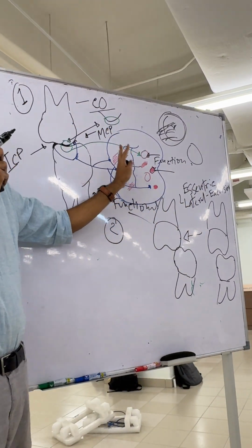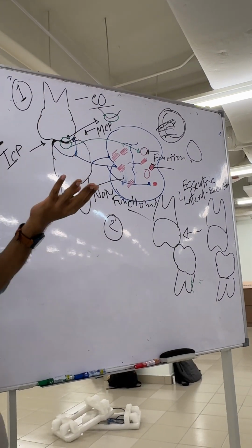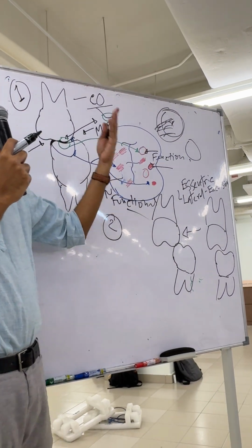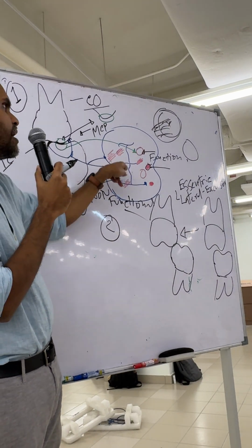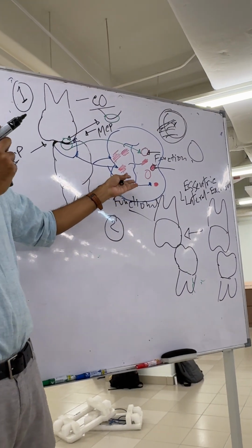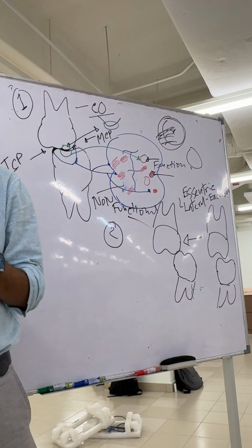The same strategy will be followed for the lateral excursion, right? When you are sliding the mandible right, left, front and back, you already have changed the color. The color is changed just to differentiate, right? So you'll be seeing the same marks and points with a different shade of color. In this case it was red, in the other case it will be dark blue or black, but you follow the same principle. You understood how I'm going to adjust it?